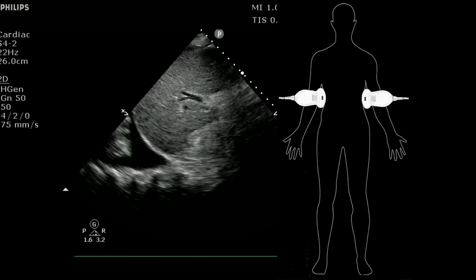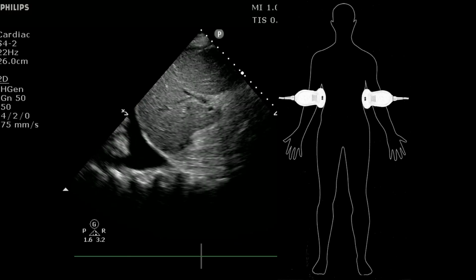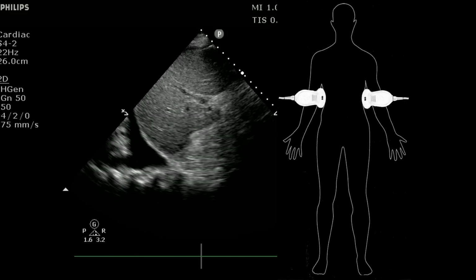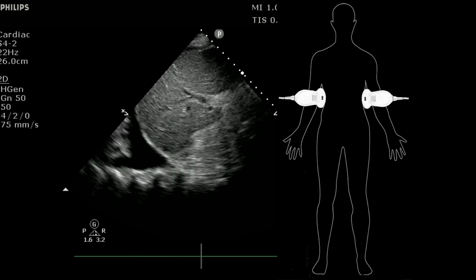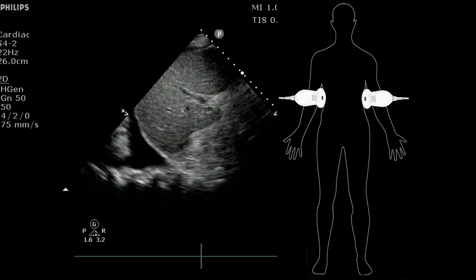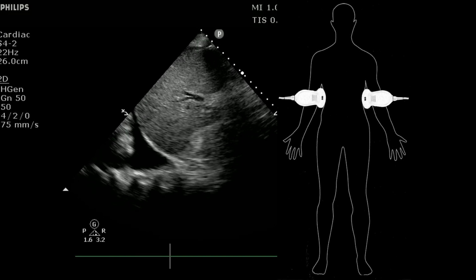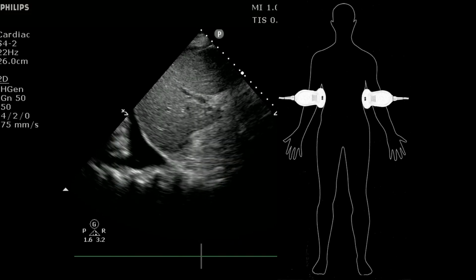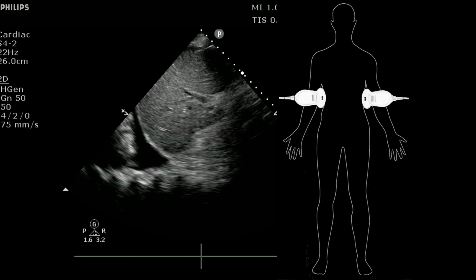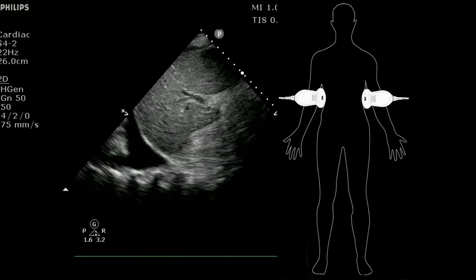I know that if I have a patient lying supine, or even a little bit in reverse Trendelenburg, with the head of the bed up a little bit, gravity is going to pull the fluid to the posterior and inferior aspect and start collecting at that costophrenic angle that's visible from the right upper quadrant or left upper quadrant window. This is an example. This clip shows where my probe needs to be on the patient's body, but also what I'm looking for: that liver, that bright white diaphragm, and then the stuff above it.